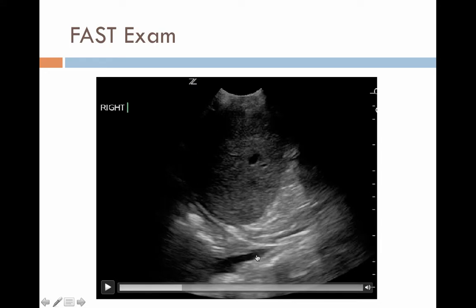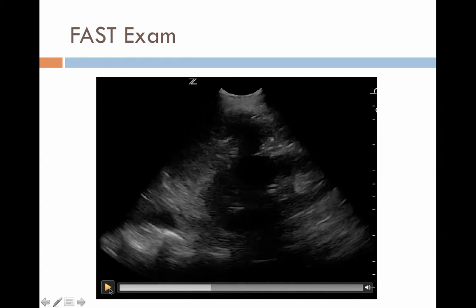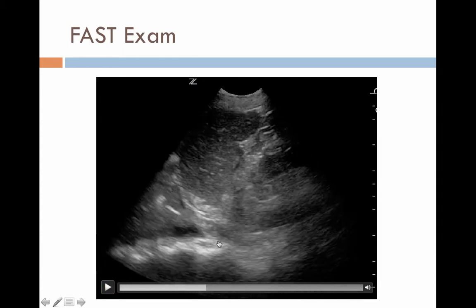We do see spine and a little bit of fluid in this patient's chest. And this is some probably squashed lung, maybe even contusion. Liver here, there may be a tiny little thin stripe of fluid right here under this diaphragm, but it's very scant, not a whole lot. And then we take some more views. So here we are on the left, and we see again the spine continuing in the chest. So even if you didn't see the fluid, which you see right here, that would be a clue that there was definitely some likely fluid or something in the chest. So there we go, fluid in the chest.